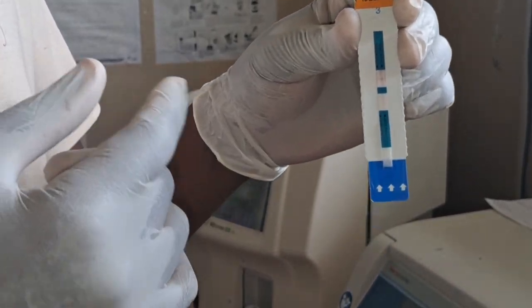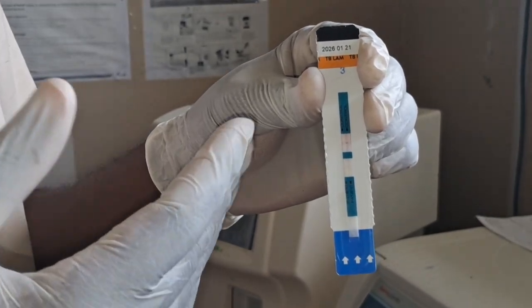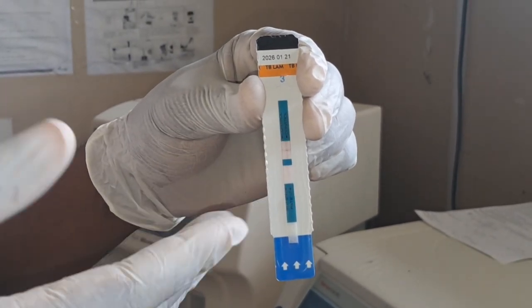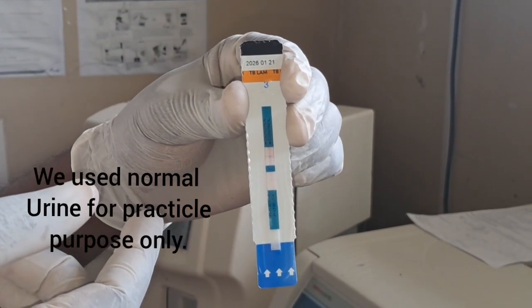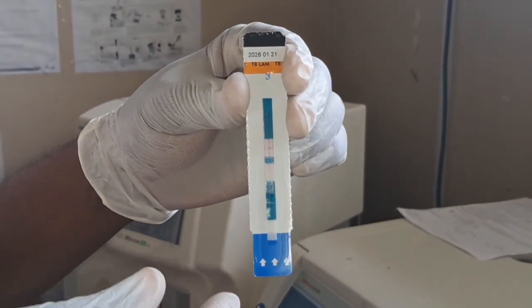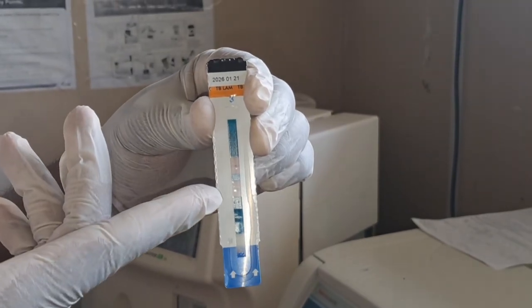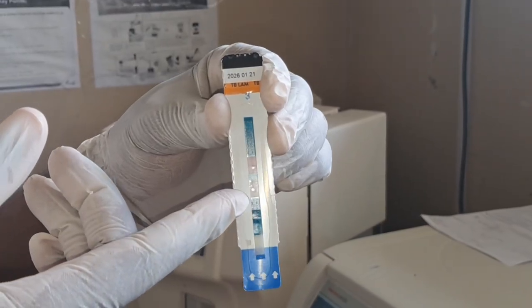For this one, since there's a control line and the test line has not come out, we can say this is a negative result. Since we are dealing with antigen tests, you would normally see us writing non-reactive. So I don't have TB. No, madam, you don't have. Now let's assume that two lines came out, the control line as well as the test line.